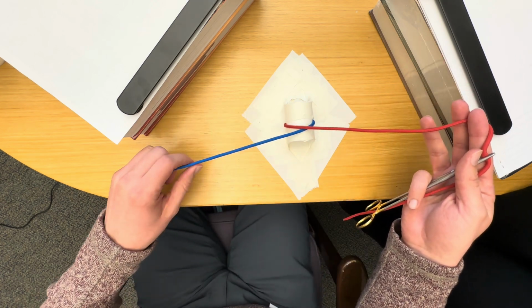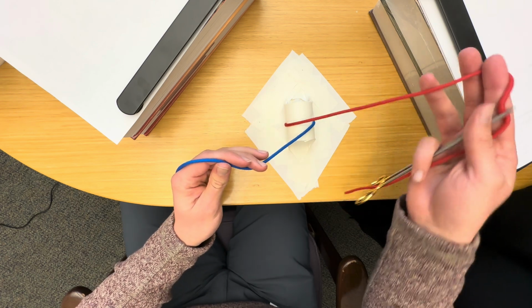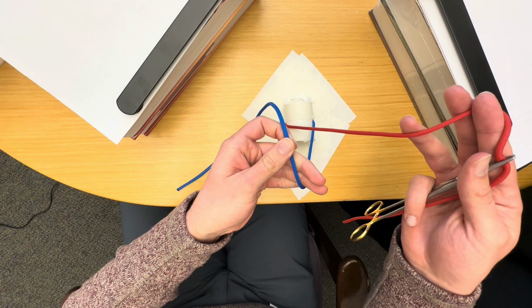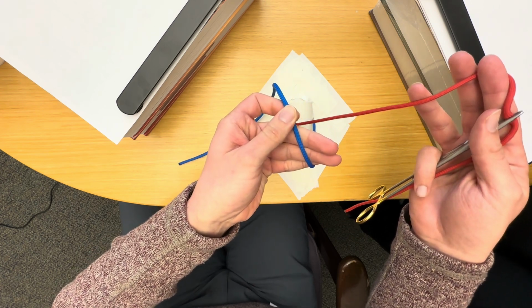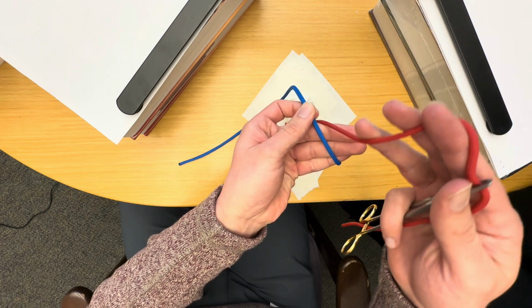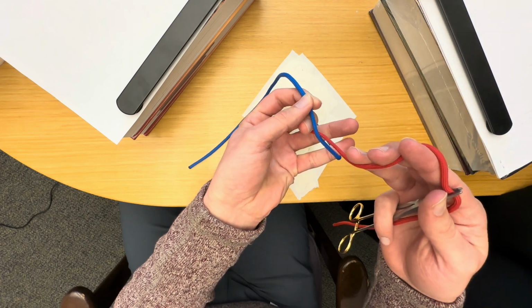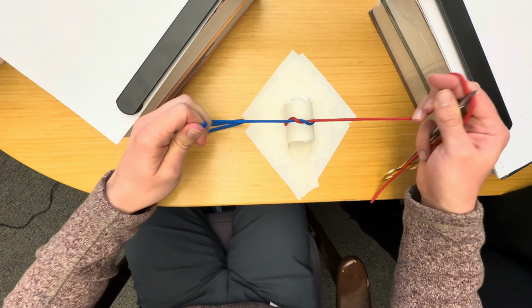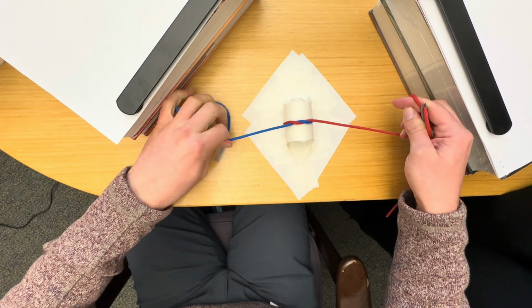So since we went over our tail string, we're going to start with what you might hear called the karate chop, where you have it over your three fingers like this. You bring the string with the needle on it and your needle driver over. You have your middle finger come grab the tail, pull it through, and lay it down flat like that. So we did our karate chop first.